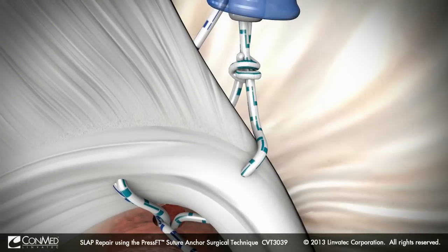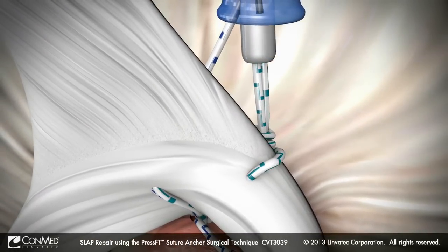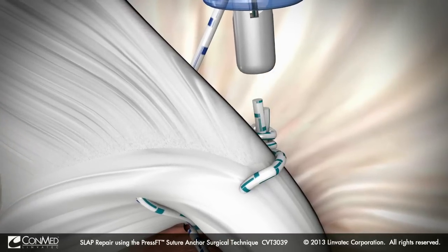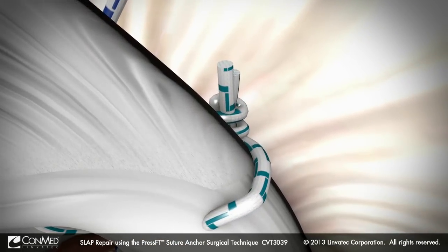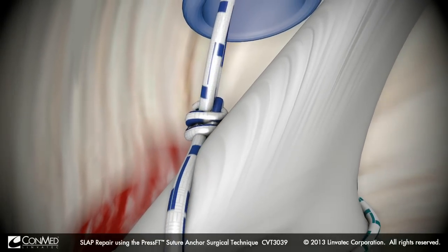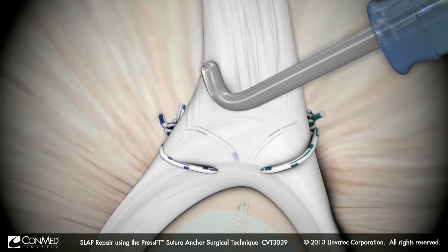Complete the anterior portion of the repair by tying the arthroscopic knot and cutting the excess suture with the Katana suture cutter. Be sure to keep the post and knot away from the articular surface. Repeat these steps for the posterior mattress stitch and probe the completed repair.